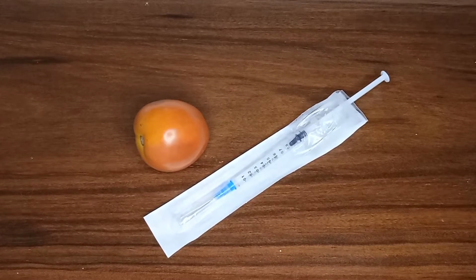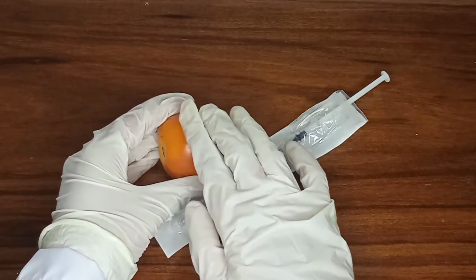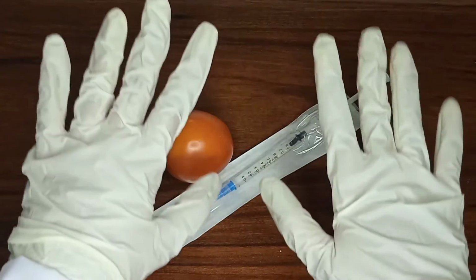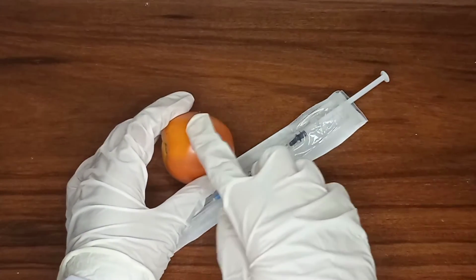Now we are going to explain the purpose of the medication, including the relevant information about the medication, and we are going to select a site free of tenderness, swelling, scarring, itching, burning, or localizing inflammation, and one that has not been frequently used. So, as if this is our selected site here, the next thing that we are going to do is to put on clean gloves. Then we are going to cleanse the site, this one.